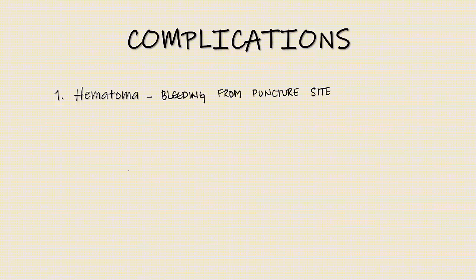FNAC is associated with relatively few complications. Number 1. Hematoma. Bleeding from the puncture site and hematoma formation are the most common complications. Firm finger pressure for 2 to 3 minutes immediately after the procedure greatly reduces the frequency of these complications. Number 2. Infection. 3. Pneumothorax.